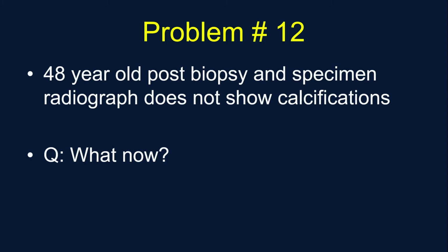Problem 12, 48-year-old, had a biopsy, and the specimen radiograph doesn't show any calcifications. I always love these. You're just like, really? It was perfectly targeted. Where are those calcifications? I doubt this happens to any of you guys either. Unfortunately, I've had this happen to me multiple times, and I've come up with some good creative solutions.